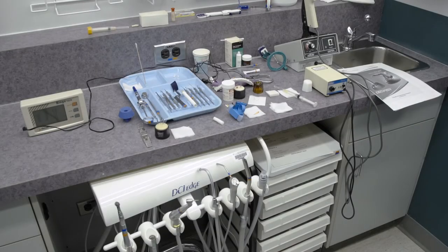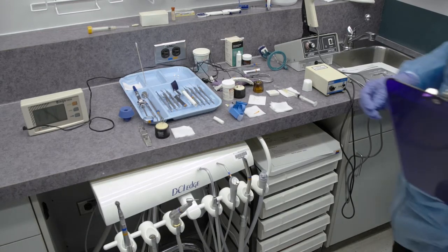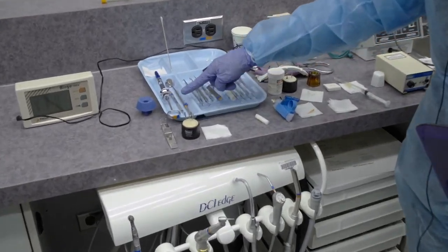So with the dental assisting root canal therapy, you will find the procedure in your assessment book. We're going to look at the instruments and the equipment involved with the procedure. The basic setup, which is the basic setup of the mirror and the explorer.